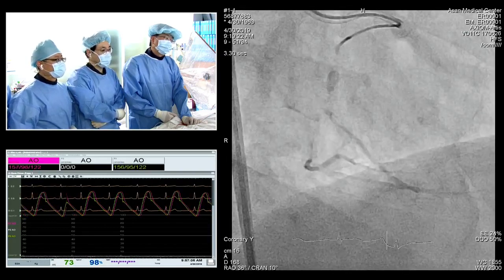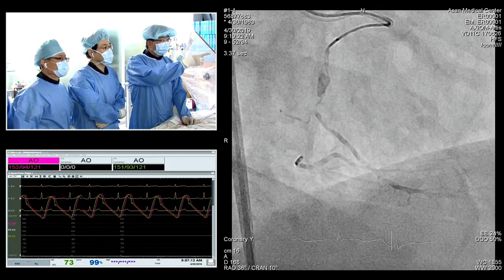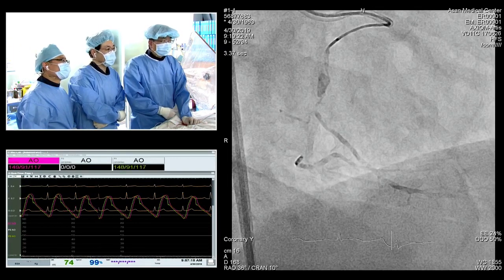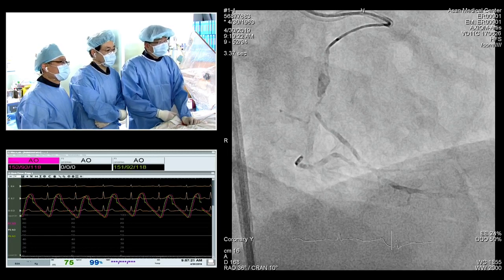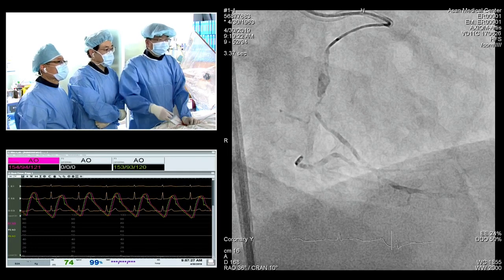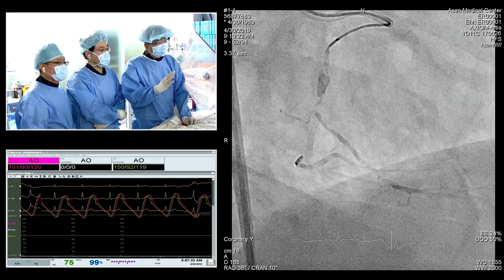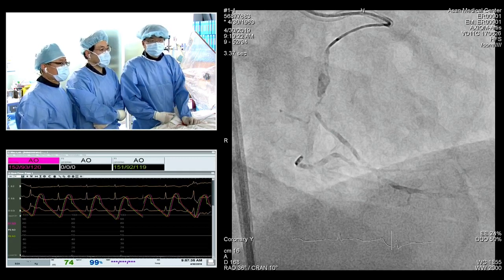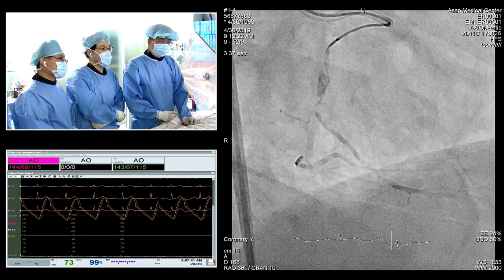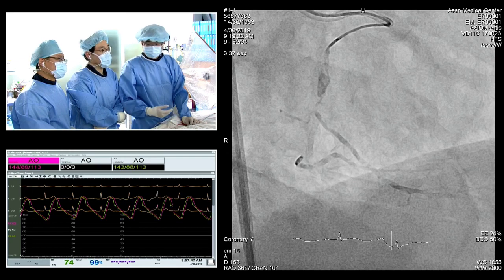Stop. Okay. So you can see here. Yeah, we can. So maybe a side branch is arising from the distal tip area. That is my target. As you mentioned, the previous failure is sometimes very helpful to wiring, sometimes there is a connection between the subintimal space or dissection plane. However, in this case, there is no definite connection between the RCA and the collateral flow. So there's a dense line inside the previous injured site. That must have a high chance of intraluminal course. Why not try? So next.